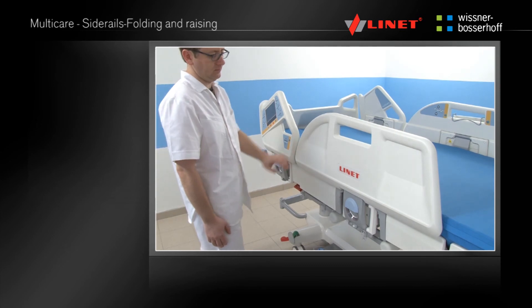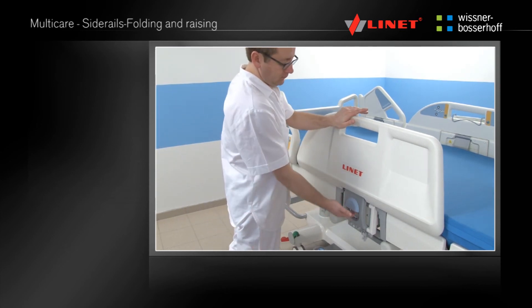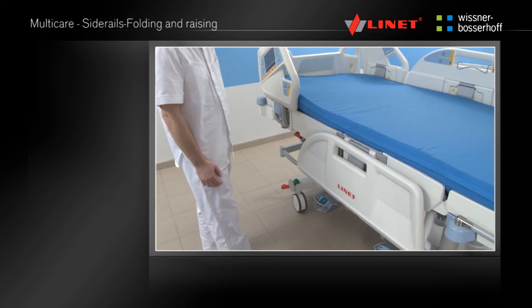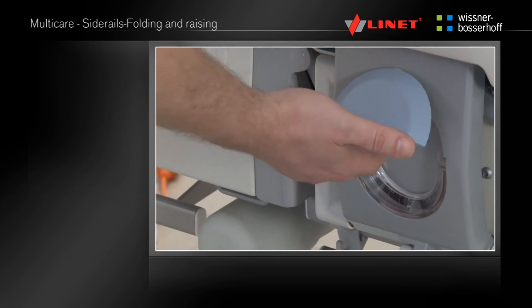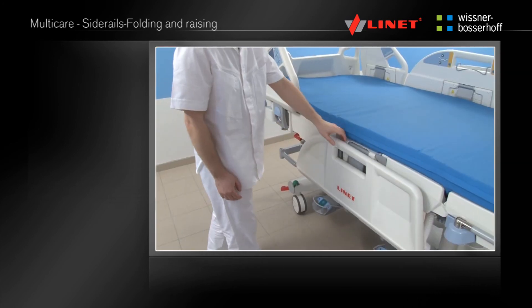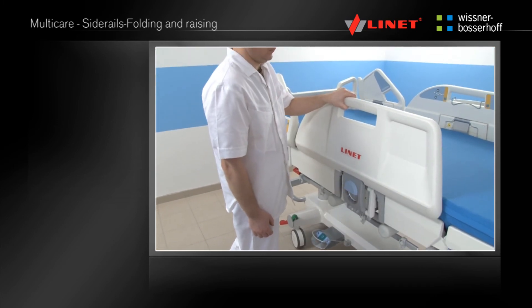To fold down the split side rail, push the top of the side rail towards the bed, release the lock mechanism and fold the split side rail down slowly. To bring up the side rail, hold the upper handle and raise it until it automatically locks in the highest position.